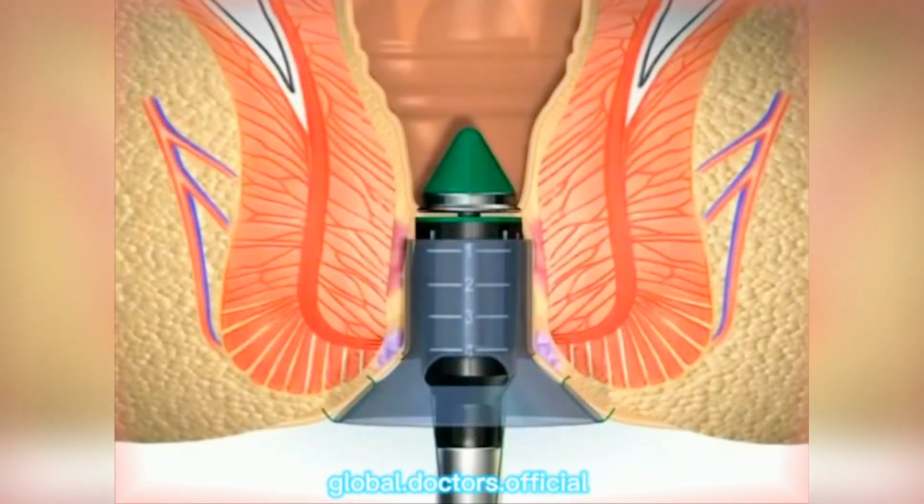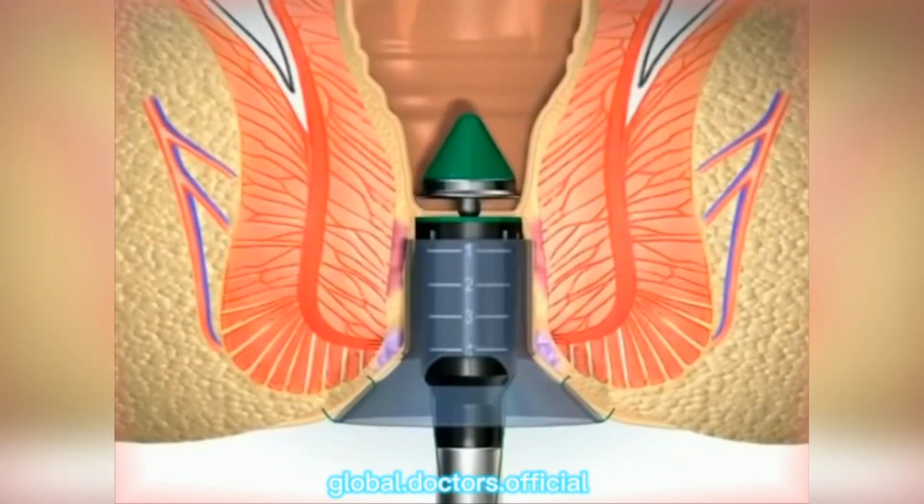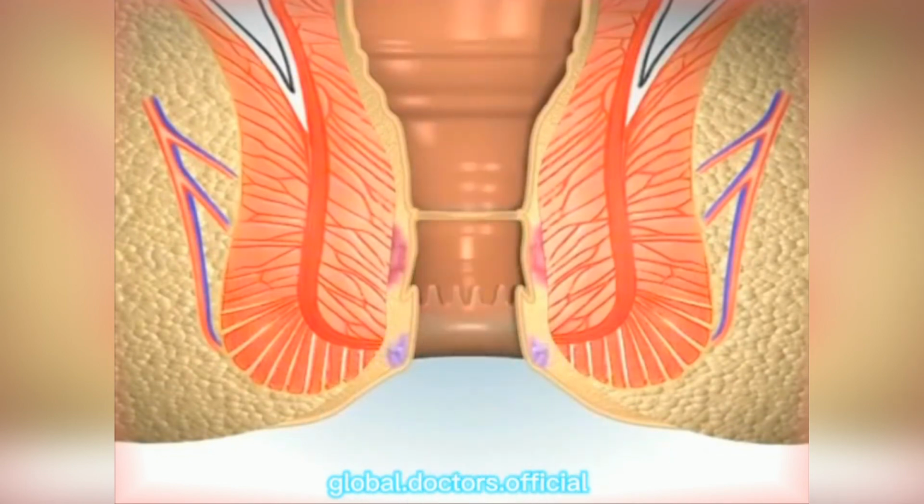Keeping the stapler fully closed for approximately 30 seconds before firing and approximately 20 seconds after firing acts as a tamponade, which may help promote hemostasis. A half to 3/4 turn of the adjusting knob of the stapler facilitates its extraction. Additional turns can cause interposition of mucosa between the anvil head and the upper edge of the circular anal dilator.